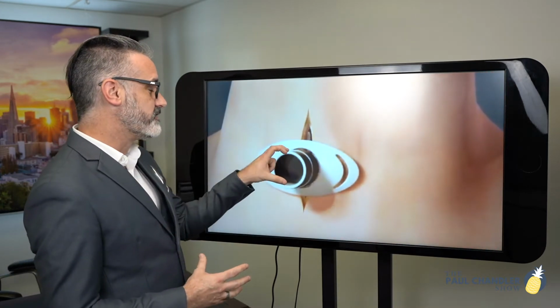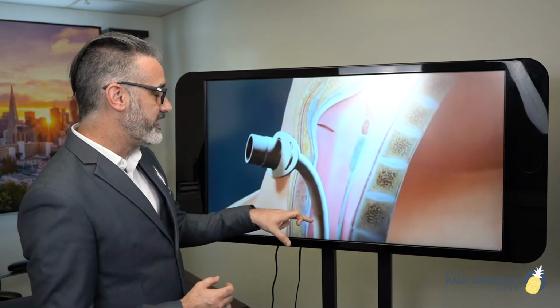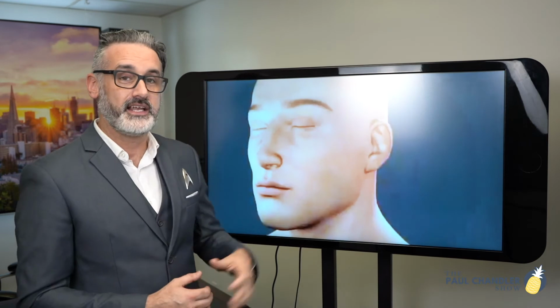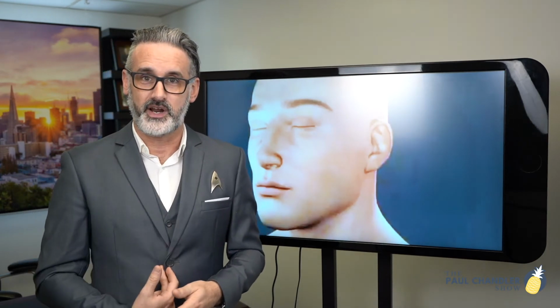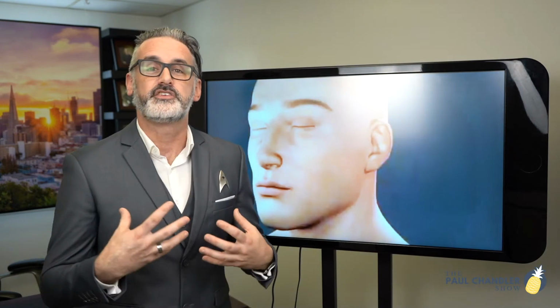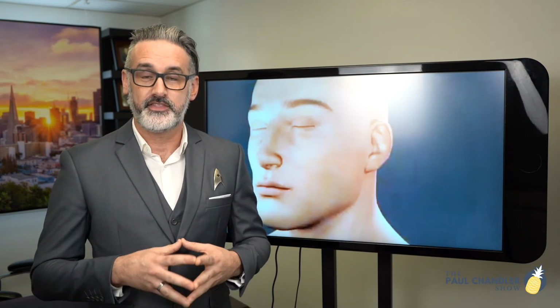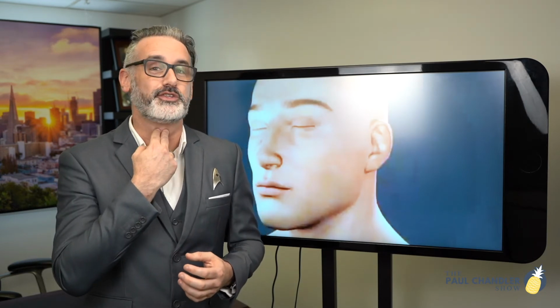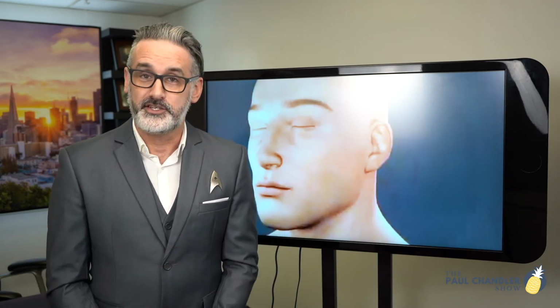At this point the doctor puts the tubing in, and it's secured in place. So now the doctor has the breathing apparatus going from the trachea down the bronchus and into the patient's lungs. So that way the apparatus itself will just go into the trachea area. When the patient is breathing, the catheter itself, the opening, is done through the trachea and not through the nose or through the mouth anymore. So it's a very simplistic procedure, but that's how we perform the tracheotomy.